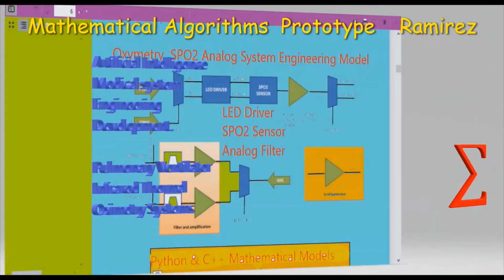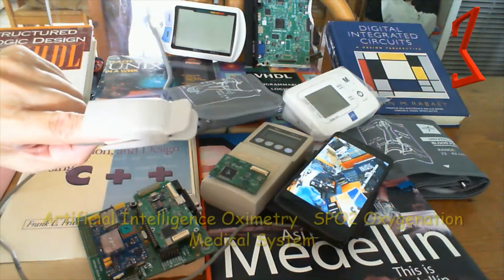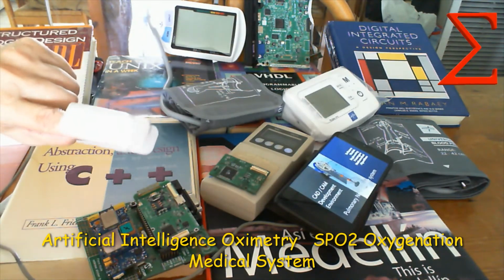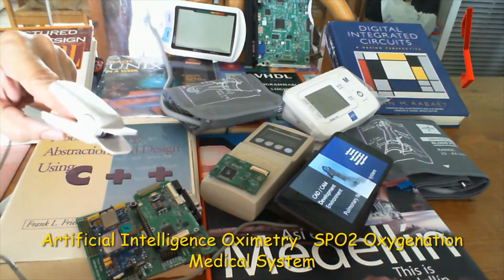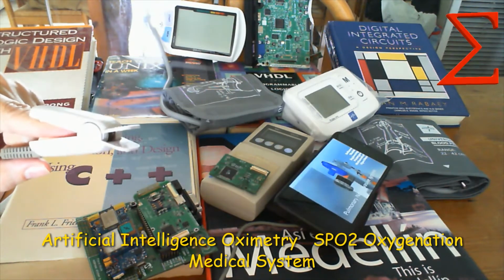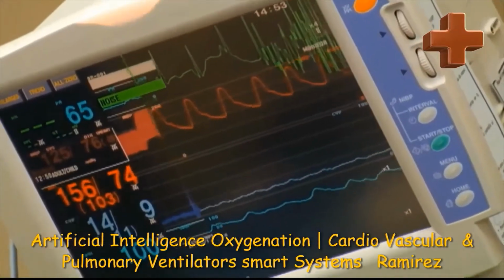The filters were made with the fast Fourier transform also included in order to retain as much information as possible after the signal processing.